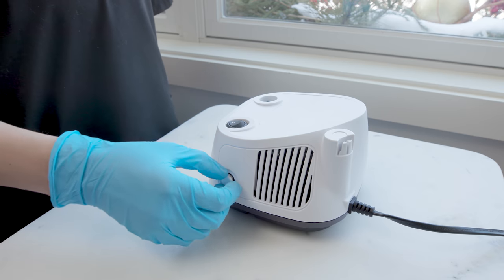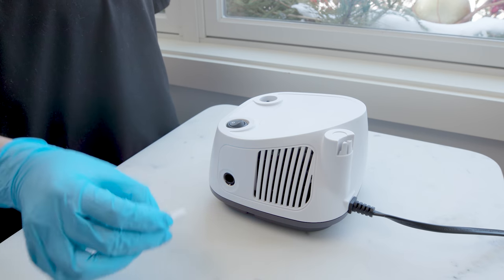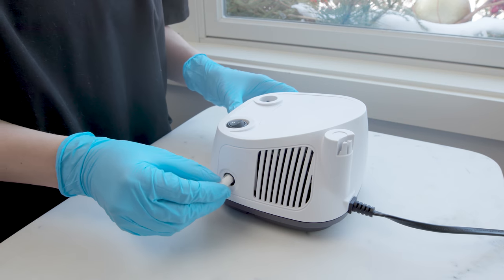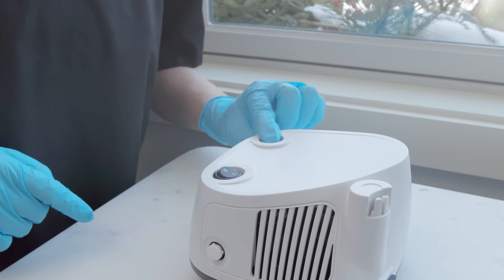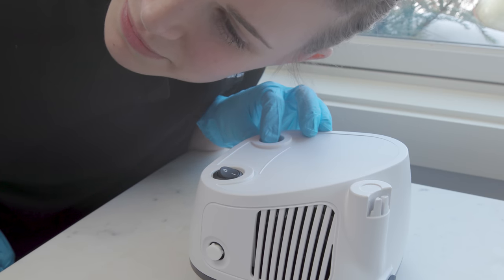If there is not a burst of air, check the filter on the neb machine and make sure it is clean. Follow the manufacturer's instructions for cleaning or replacing the filter. Then, check for airflow from the machine again. If there is still no burst of air from the air outlet port, contact the medical equipment supplier.